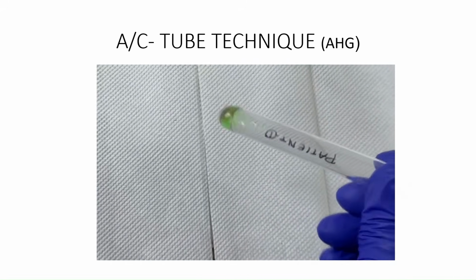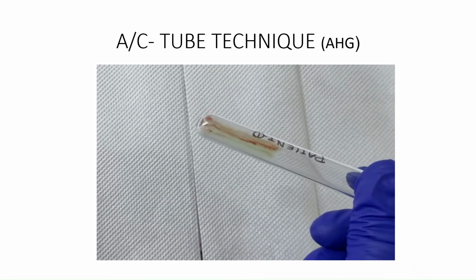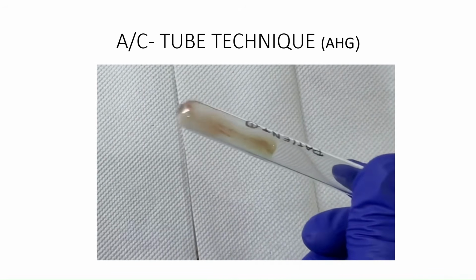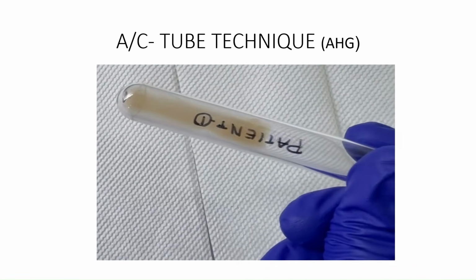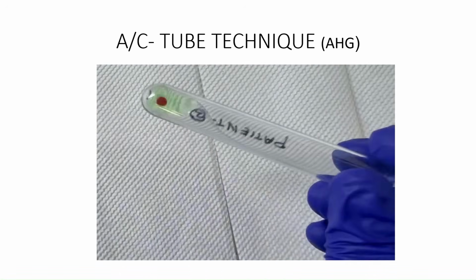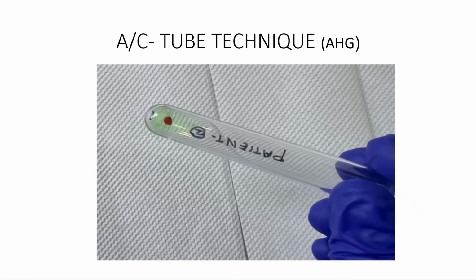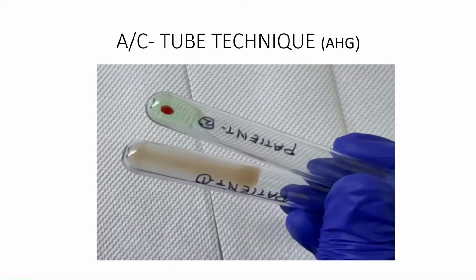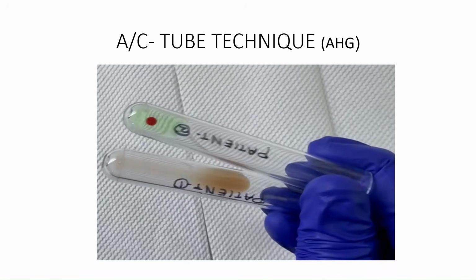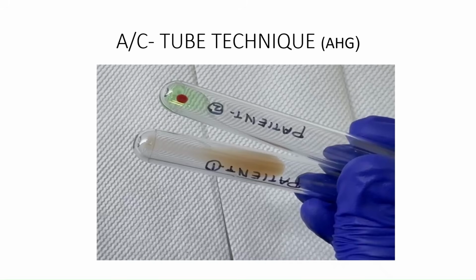After centrifugation, here we can see still the patient 1 has negative autocontrol and patient 2 has 4 plus positive agglutination reaction at AHG phase. So at AHG phase also patient 1 has negative autocontrol and patient 2 has 4 plus positive autocontrol.